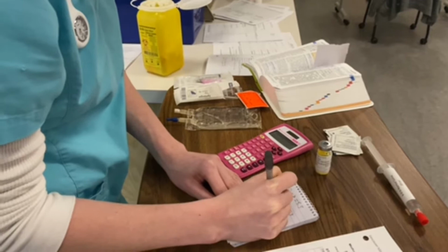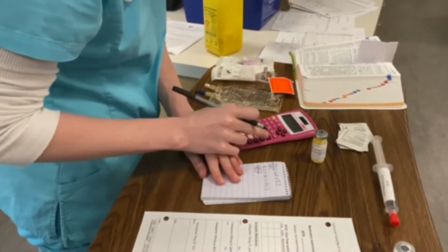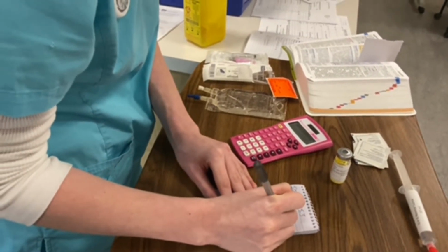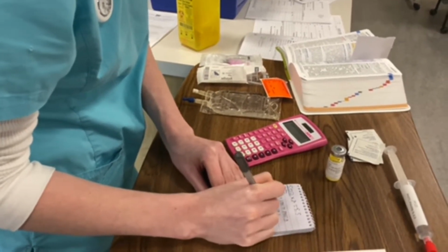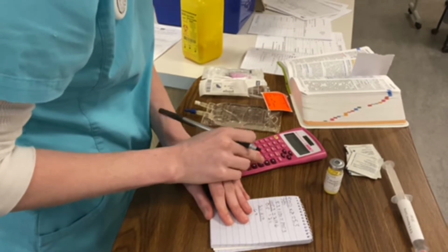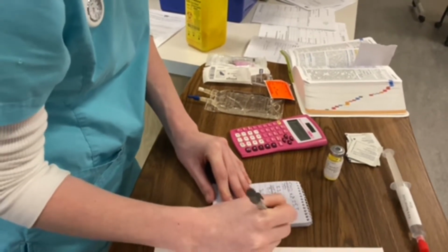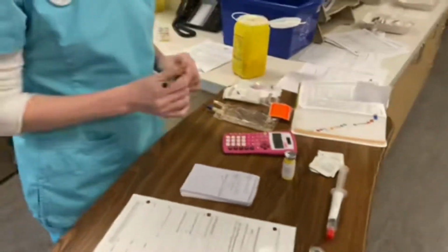105.3 divided by 0.5 is 210.6, rounding to 211. 211 times 10 divided by 60 is 35 drops per minute. And now I'm ready to start my first check.